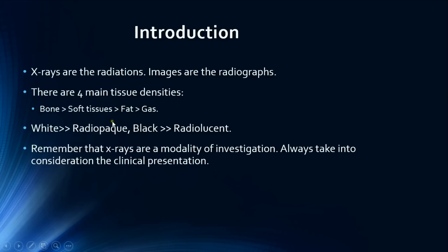In general there are four main types of tissue densities: bones being the densest tissues which appear white on the radiographs, soft tissues which appear as light gray, fat which appears as dark gray, and finally gas which appears black because it is the least dense tissue.